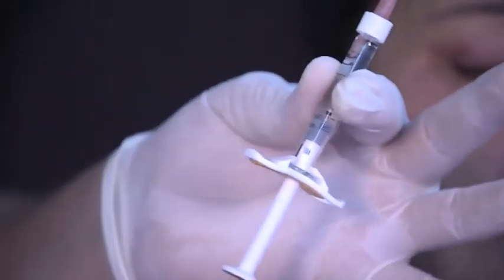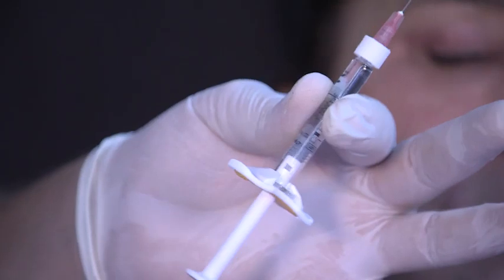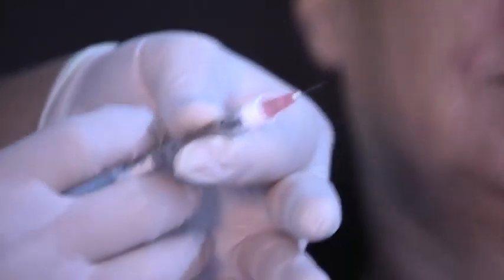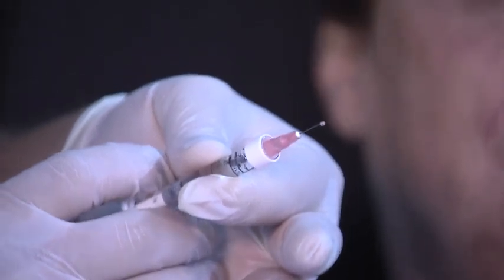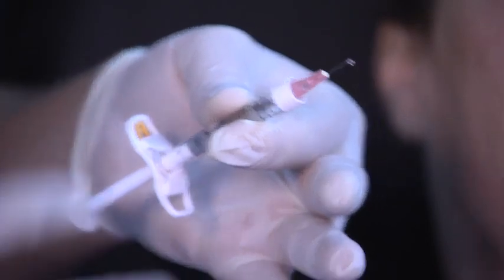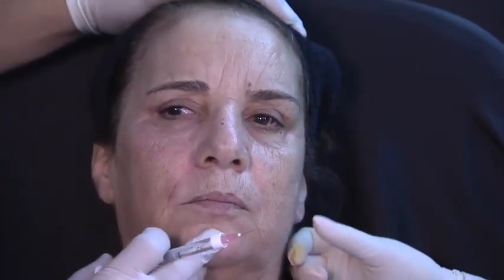Okay? Right. This is my skin booster. This is Vital, 20 milligrams per milliliter. Remember that we have the clicker, the system of the clicker. I think it's really great. Okay, so we're going to press the clicker that allows us to have a 0.01 deposit. So it's 100 injections per milliliter. Okay, for the first 1 or 2 clicks, you won't hear the clicker till you see the exit of the drop.